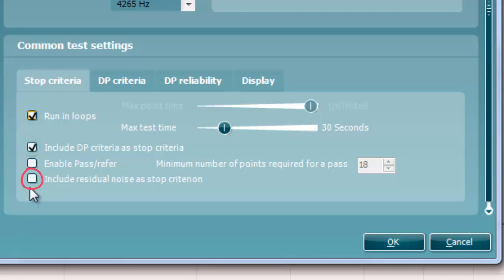Selecting Include residual noise as the stop criterion causes the system to stop testing at an intensity for which the residual noise has reached its indicated residual noise floor. The measurement at this specific intensity is considered to be so silent that a DP OAE would have been detected if it were present.